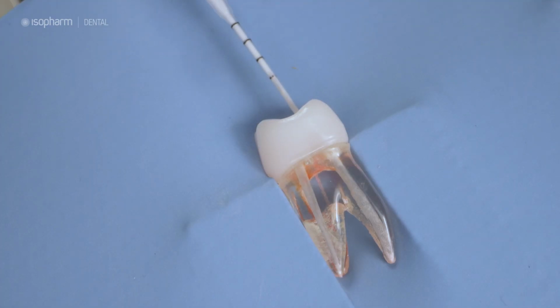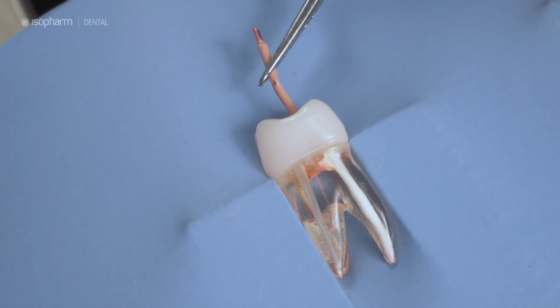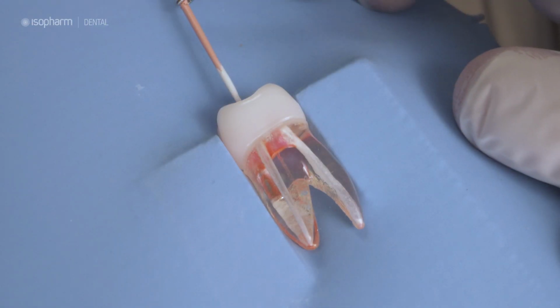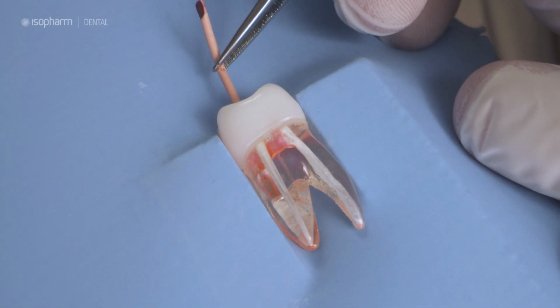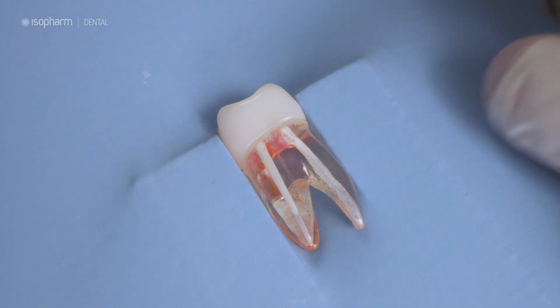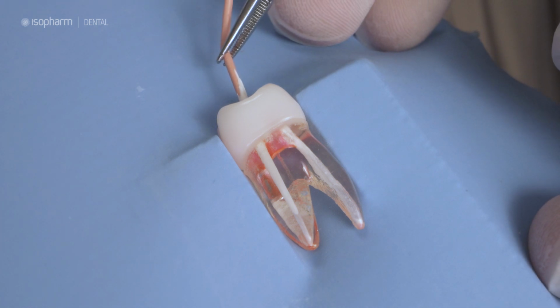So there are two ways of using your bioceramic sealers. You can either inject them into the coronal part of the canal and then coat the GP point and pass that down to length, or you can dip the GP cone in some of the sealer, and I tend to use the syringe tip as a little well. So use that syringe tip as a well, coat the tip of the GP point, pass that down to length, taking your sealer down to length, and then do a second dip to coat that GP point and fill up the root canal.